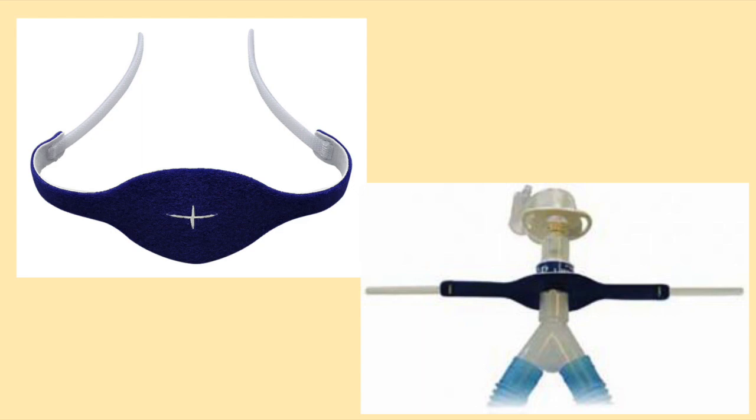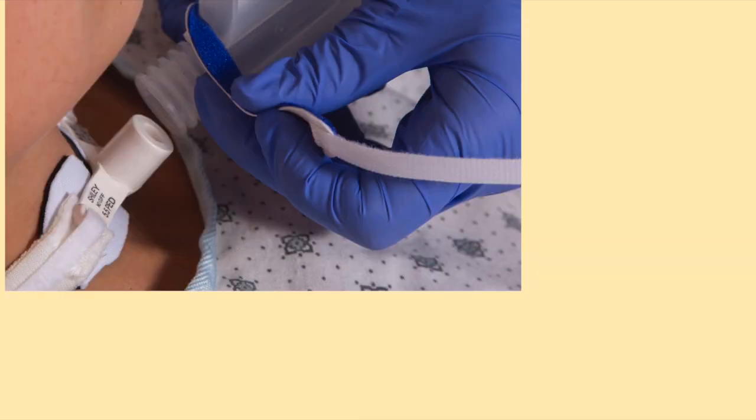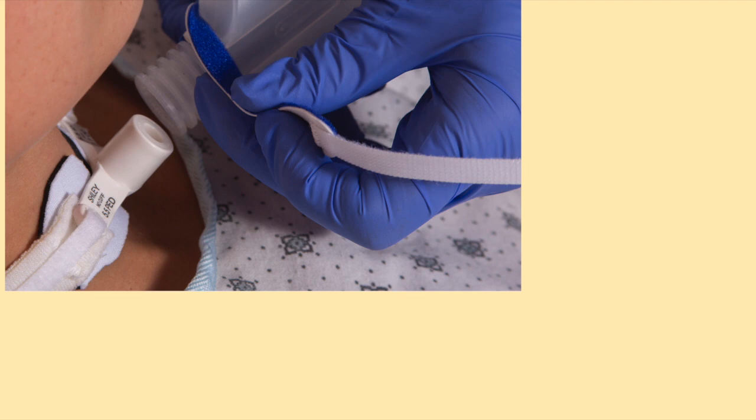Some people enjoy a more secure attachment and use a product called an anti-disconnect. This strap is placed on the ventilator tubing, which is then attached to the tracheostomy tube. The strap then attaches to the tracheostomy tube holder via Velcro, anchoring the ventilator tubing to the tracheostomy tube and preventing it from disconnecting.